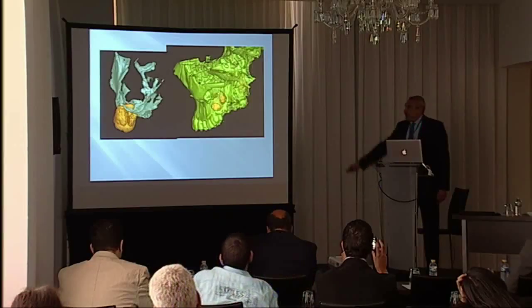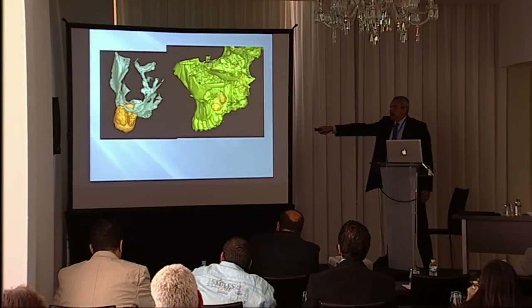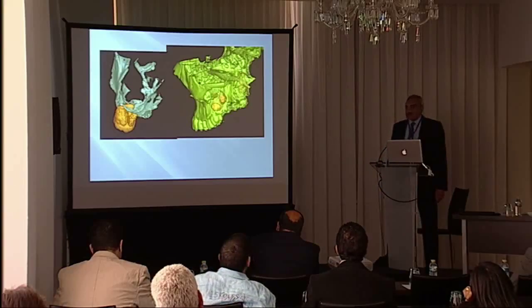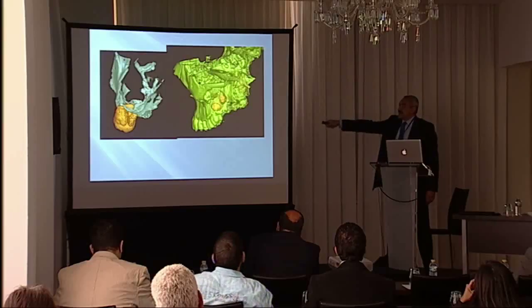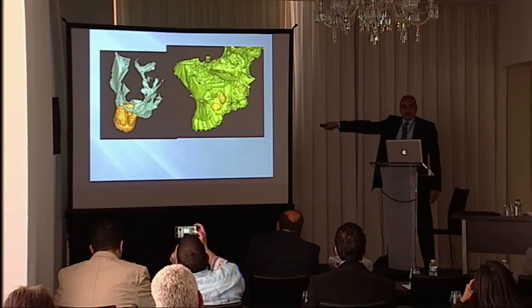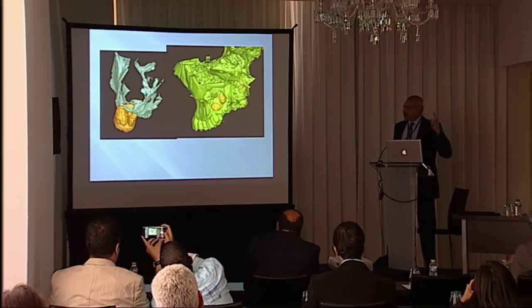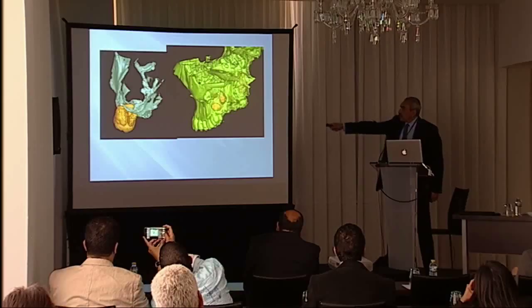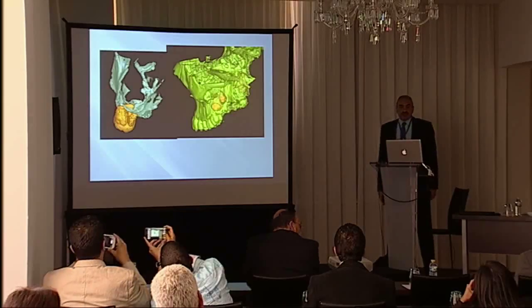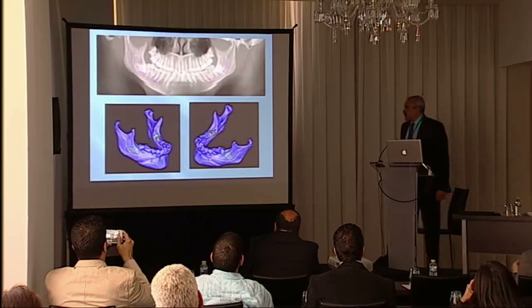You can see the roots of wisdom teeth that are really inside the maxillary sinus, and I can tell you that in this case, I couldn't see that distomolar impacted except when I did the 3D model, because it looked like one tooth impacted. Here is the first molar, second molar, this is the third molar, and this is another molar, which is a distomolar that was evident only after doing the 3D models.